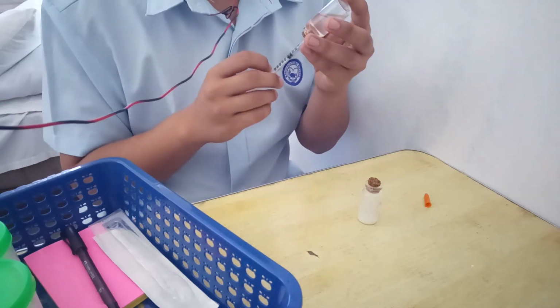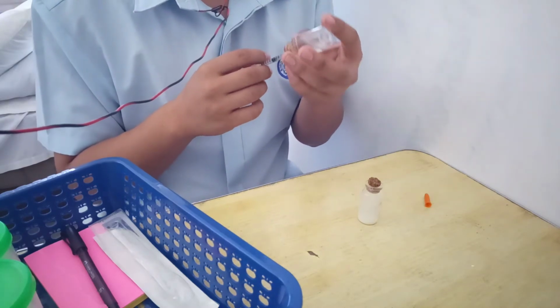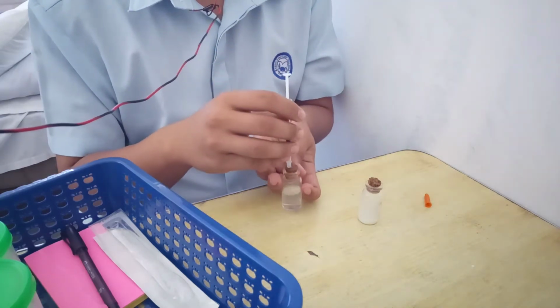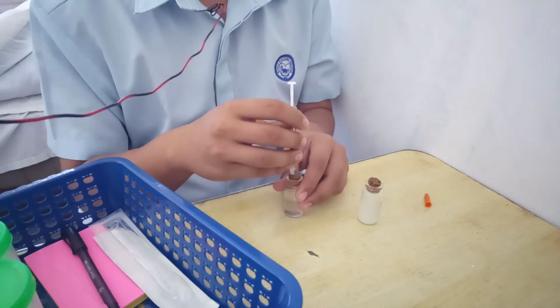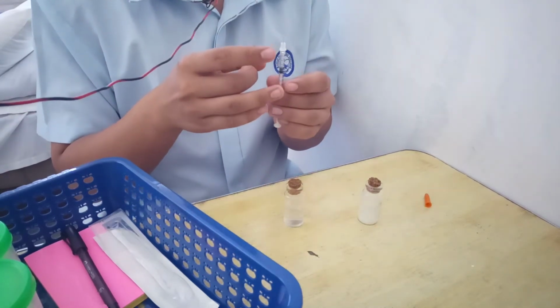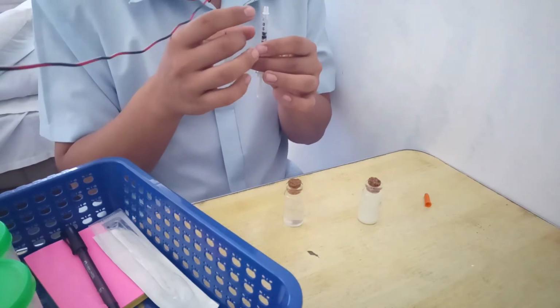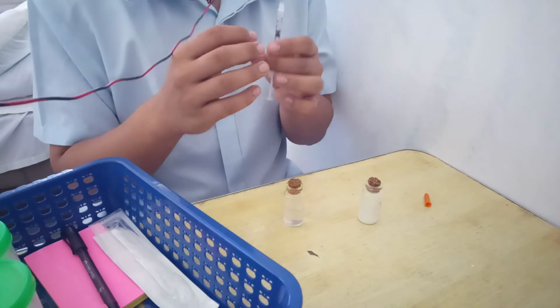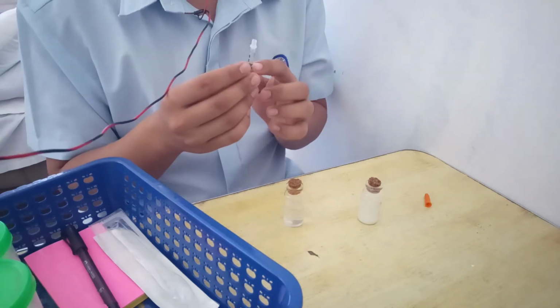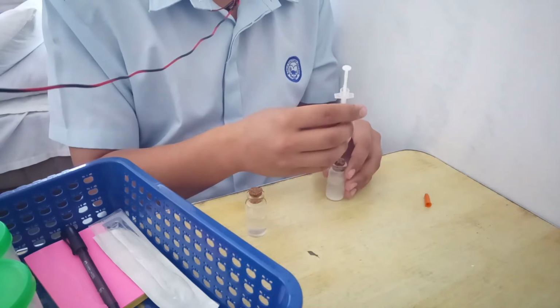After withdrawing 20 units, turn the vial over and remove the needle from the vial. Check if there are any bubbles. Next, insert the same syringe, this time in the cloudy insulin.